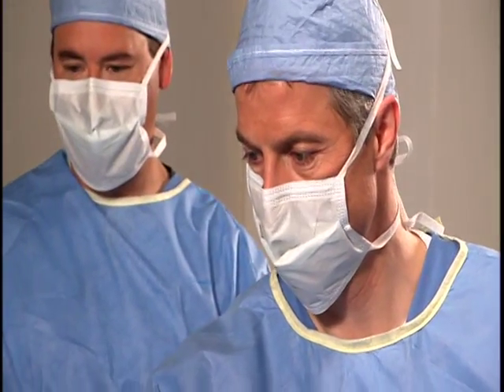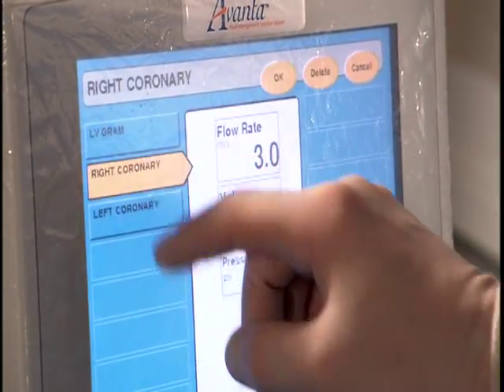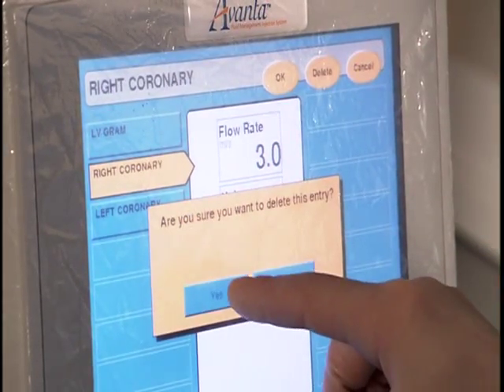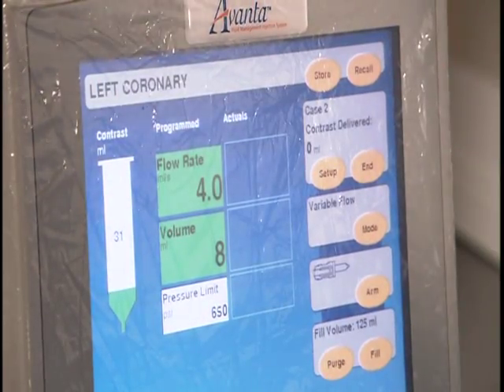To delete a protocol, touch Recall and select the desired protocol. Touch Delete and respond to the prompt. Touch Cancel to return to the main protocol screen.